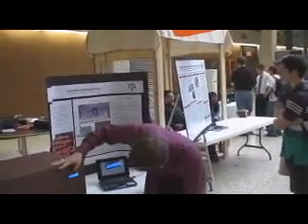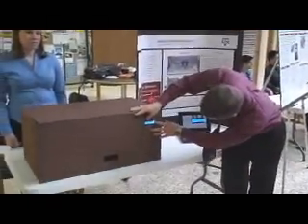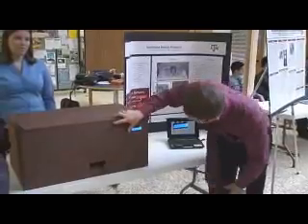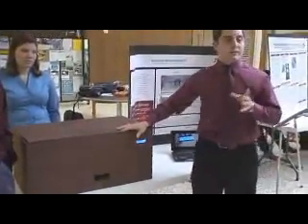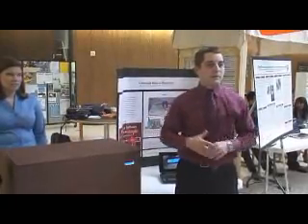So this one we're going to set the first time as we can set it on, and then we can set it for 12:30. So we can cycle through the different other times. And then we have D1 and D2. There's two different types of pills in here. Or there can be two different types of pills. We just have the same type.